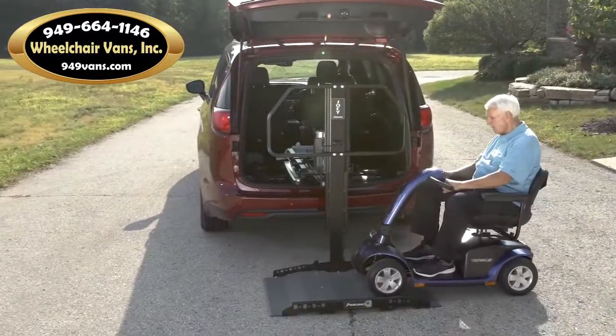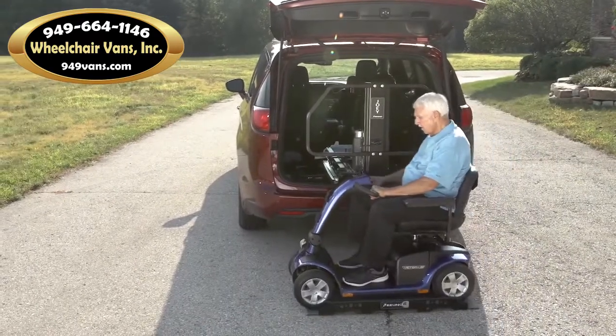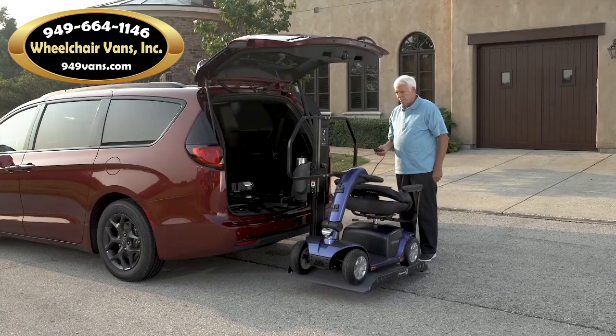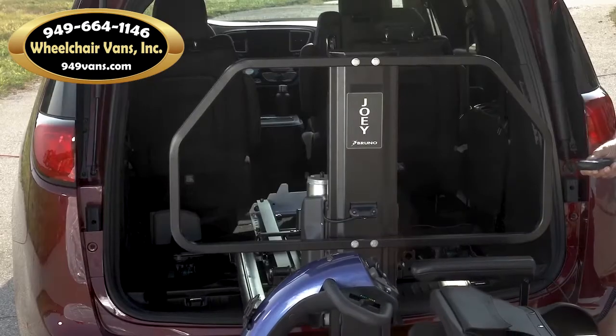Ride a scooter or power chair onto the platform until the wheels catch in place. Push the button, the lift retracts into the cargo area and you're ready to go.